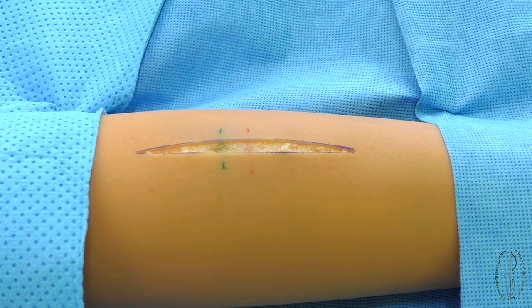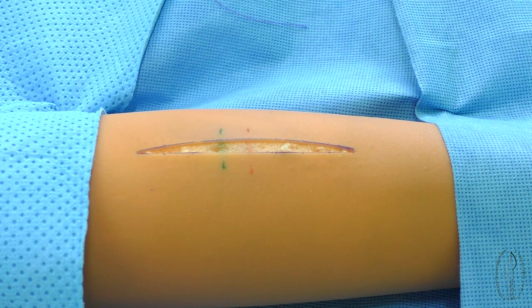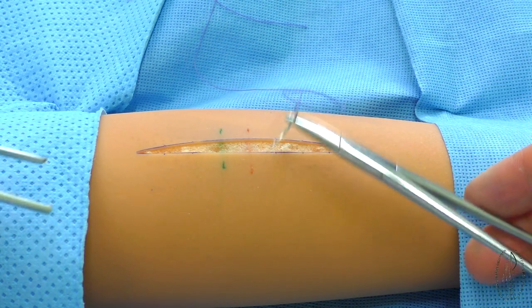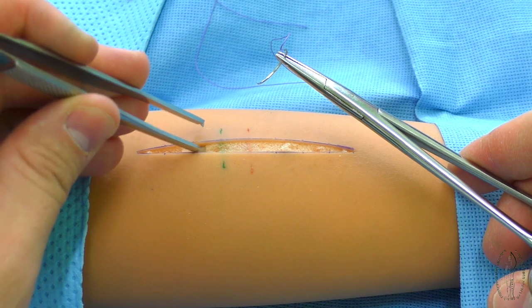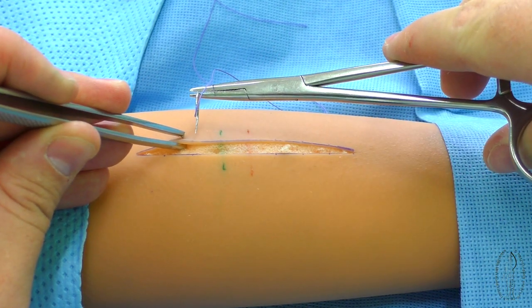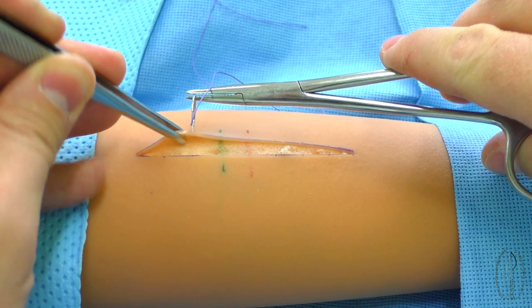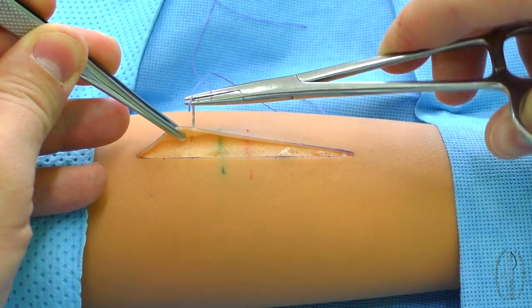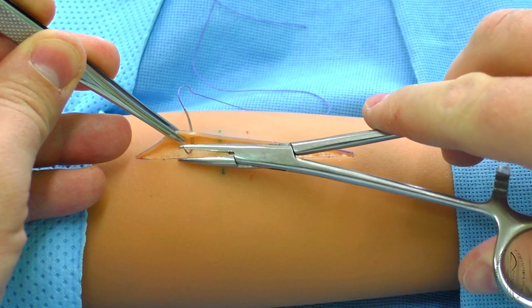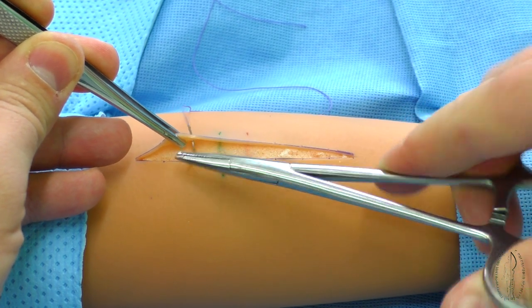The skin incision edge is fixed by the surgical tweezers and turned away from oneself. The needle with the filament is inserted perpendicularly to the skin surface by a rotary movement of the needle holder, following the curvature of the needle.